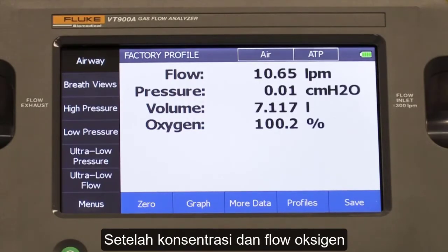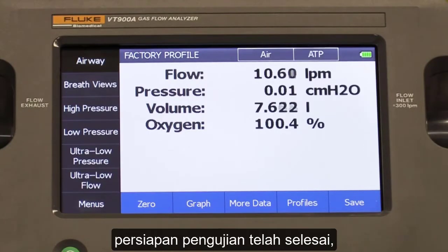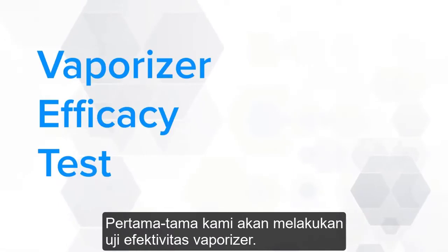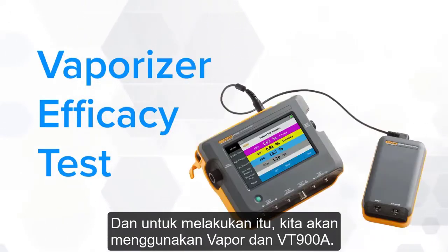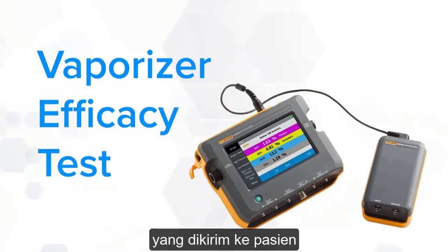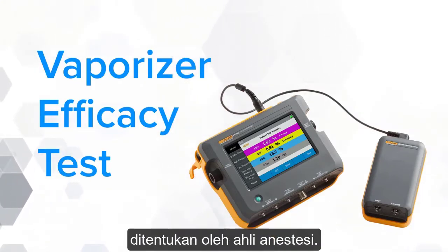Once oxygen concentration and flow have been verified to be within acceptable limits, test setup is complete and we are ready to commence performance testing the anesthesia delivery system. We will first perform an efficacy test of the vaporizer, and to do that we will be using vapor and the VT900A. Vaporizer testing confirms that the concentration of anesthetic agent being delivered to the patient is identical to the intended concentration determined by the anesthesiologist.